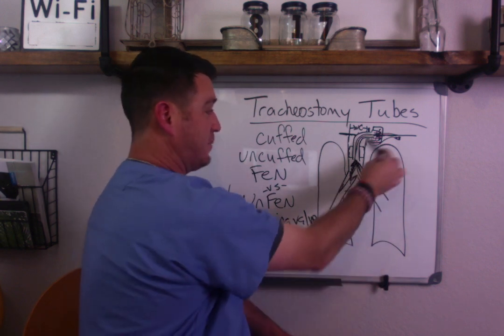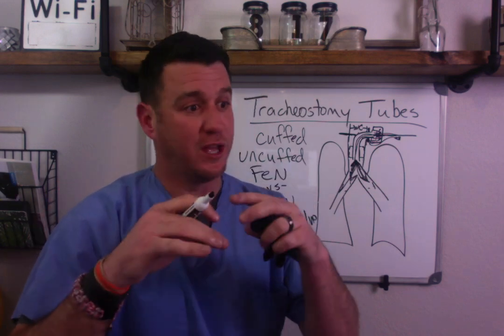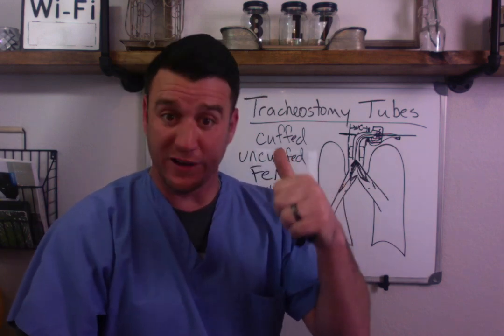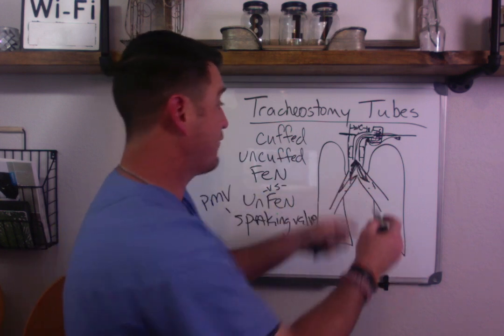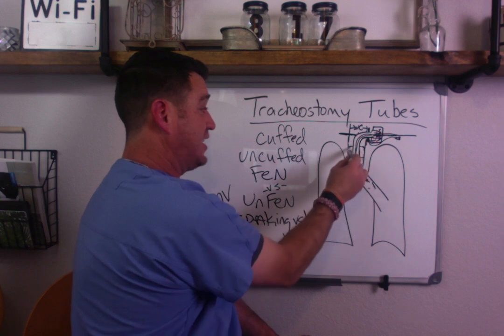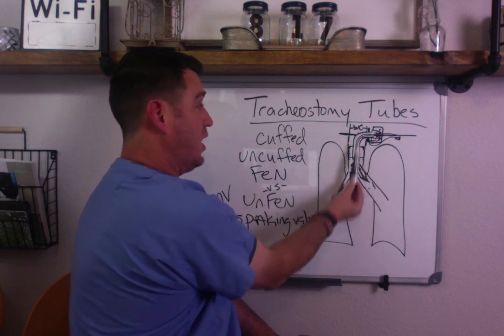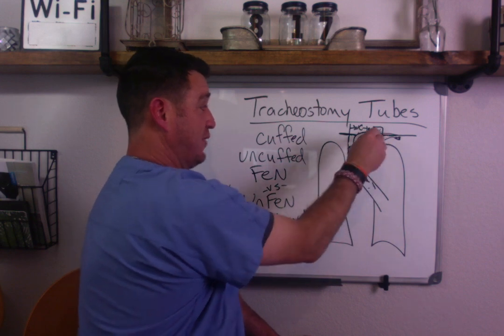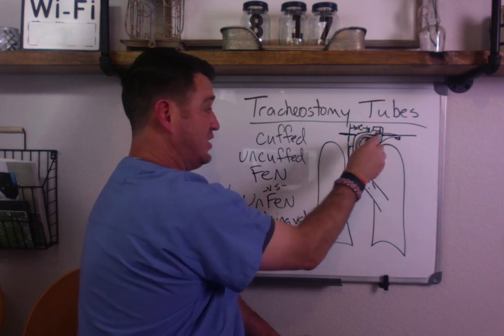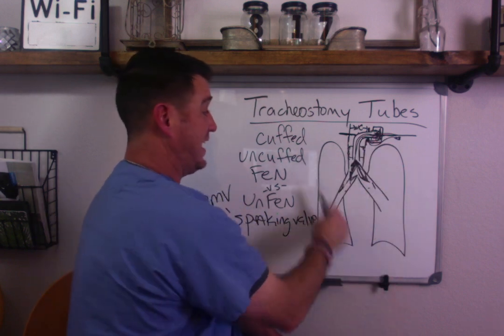So every time your patient takes another breath, they're going to develop distress very, very quickly, because with every breath there's more volume coming in, but the volume can't get out because the cuff being up won't allow it to go up past the vocal cords. The valve on the speaking valve is shut, so the air has nowhere to go except to stay in the lungs.